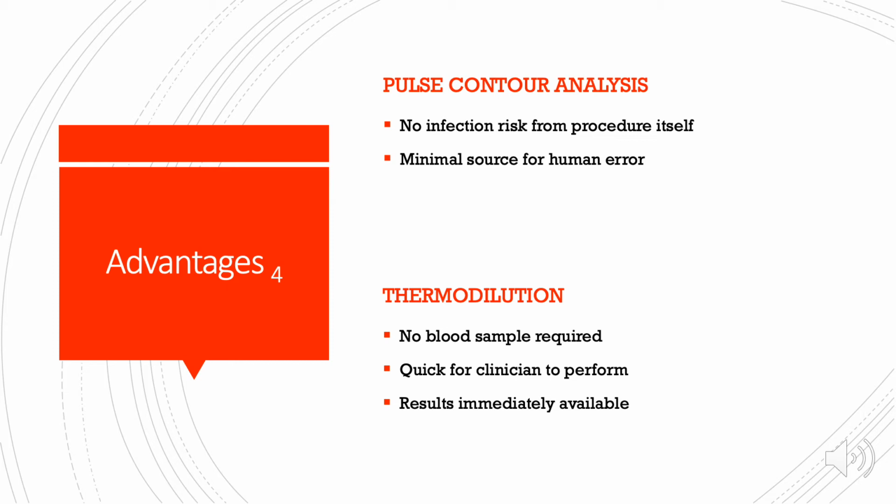going on. For thermodilution, the advantages are that you don't have to take a blood sample to get the cardiac output value. It's very quick for the clinician to perform. It doesn't take a long time, and the results are available to the clinician immediately.